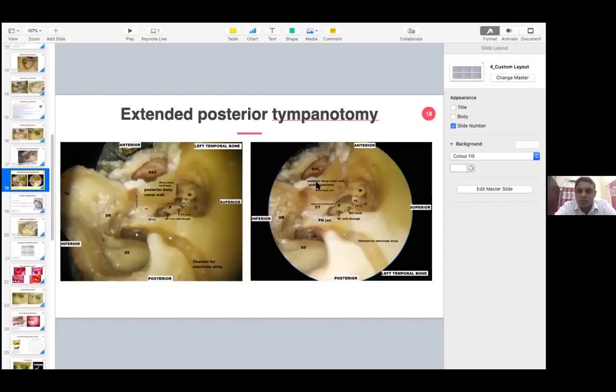So once you make only bony cuts, you push the bony canal wall. It will not open into the external auditory canal, but it will yield. So you open it by pushing the bony canal wall. You gain access to the middle ear here. Once you do the procedure, again keep this back like that, so that the external auditory canal is not opened. Why? Because the canal skin is intact. You can again seal these vertical cuts either with bone wax, or you can use a bone paste mixed in antibiotic steroid.